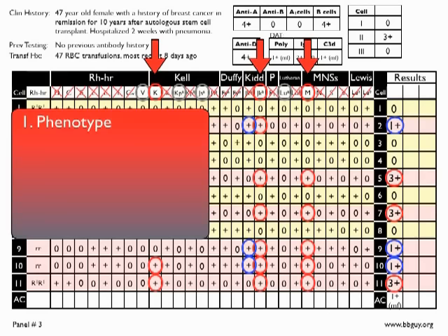Beg your pardon. Okay, so what would we do? Well, one of the things that we would potentially do is phenotype. If we did the phenotype and we got really lucky and we saw something like this, where this individual is positive for big K, positive for M, and negative for JKB, that would certainly argue strongly in favor of it just being an anti-JKB. Of course, it doesn't always work out that way, so that may help, it may not help. Phenotyping, though, is an essential part of the workups.